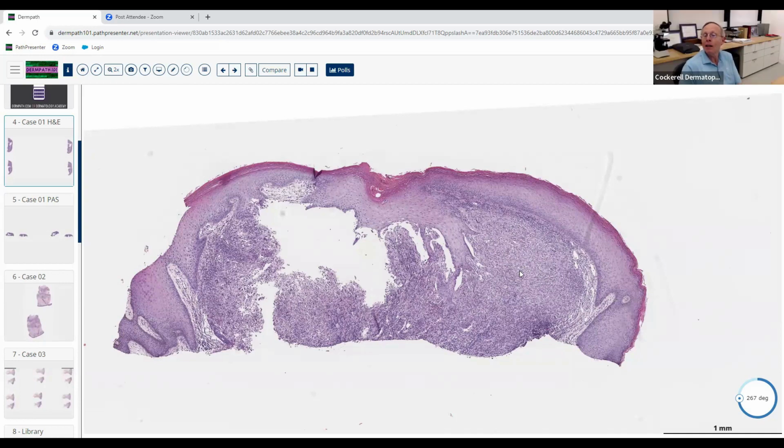You don't know, that's perfectly fine. Maybe? Well, generally, if you see histiocytes. Oh, histiocytes, yes. Good, excellent. And if it's histiocytes that predominate, like here, they're the majority of the cells here. What do we call that type of inflammation when histiocytes predominate in an infiltrate? Granulomatous. Good, excellent. So we got a shave biopsy. We kind of wish we might have had a punch biopsy, but we don't have that. But we got a shave biopsy, histiocytes predominate, granulomatous inflammation.